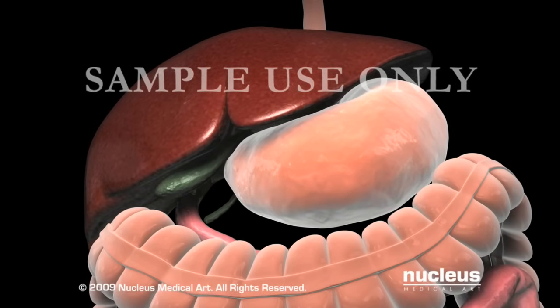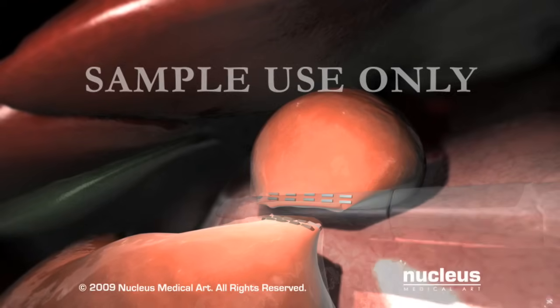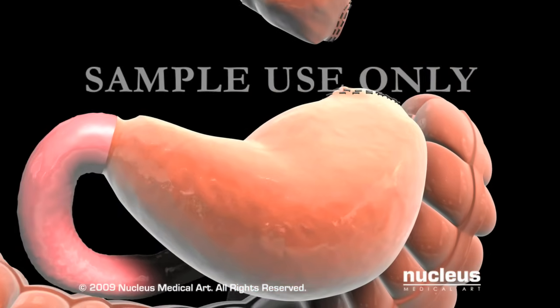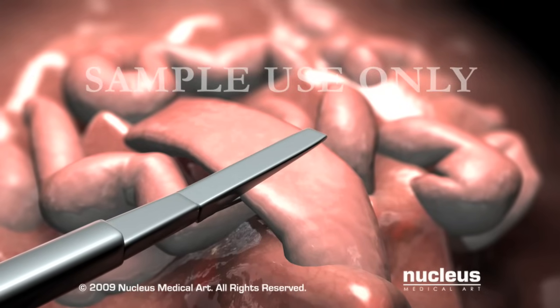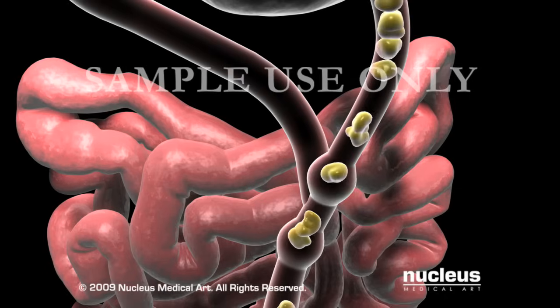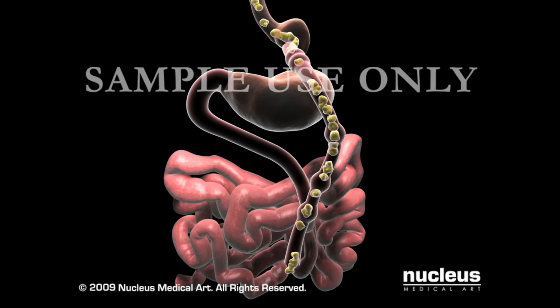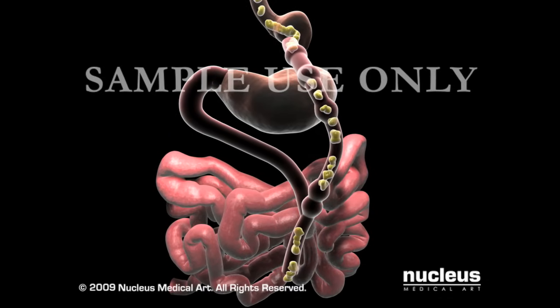During a Roux-en-Y gastric bypass procedure, your surgeon will use surgical staples to create a small compartment, which will serve as your new stomach. This pouch will hold about one cup of food. The lower portion of the stomach continues to secrete digestive juices, but does not receive food. Next, your surgeon will cut the small intestine well beyond the stomach and bring one free end up and attach it to the pouch. He or she will then attach the other free end lower down on the small intestine, creating a Y-shape. By bypassing the lower stomach and the first part of the small intestine, fewer calories will be absorbed as food passes through this new pathway.